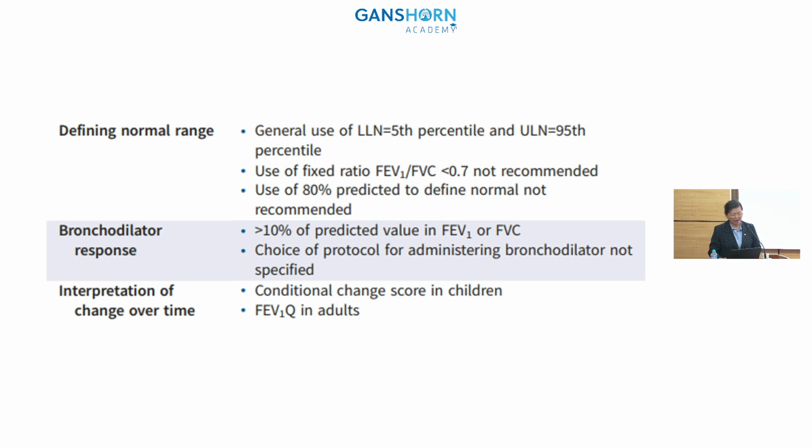Interpretation of change over time: they have a conditional change score in children and FEV1Q in adults, but it is still not very widely applicable.